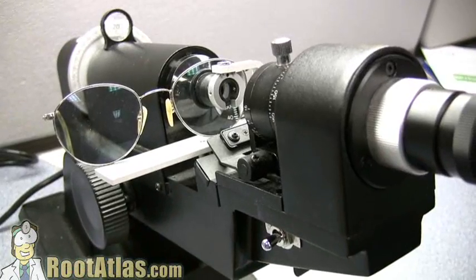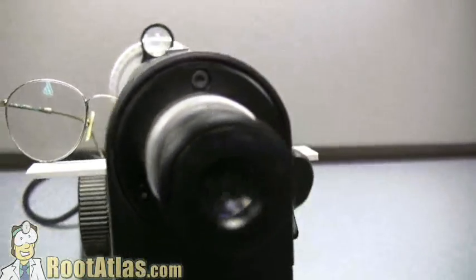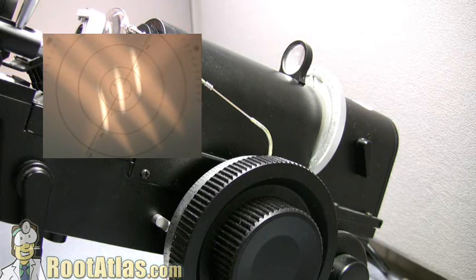Turn it on and then look through this eyepiece, and this is what you should see. The hard part with using this machine is you have to use two dials at the same time.